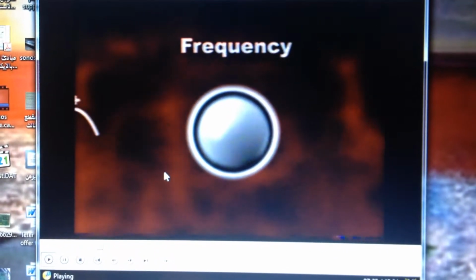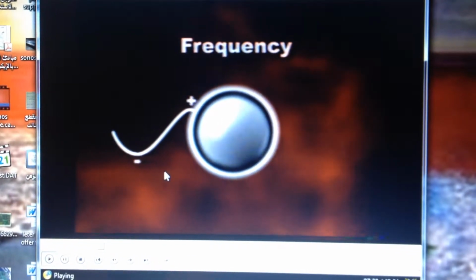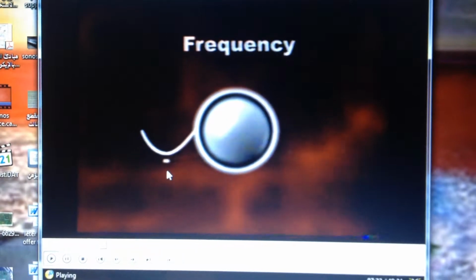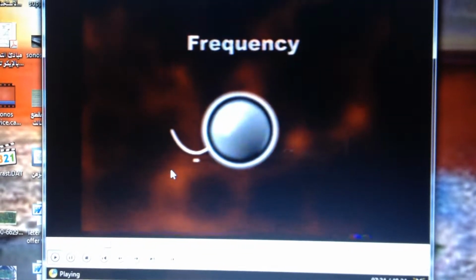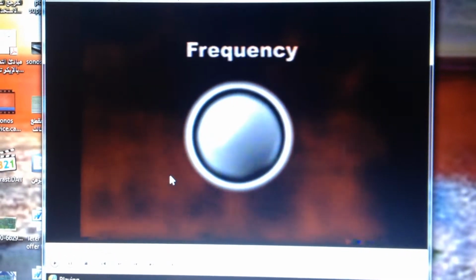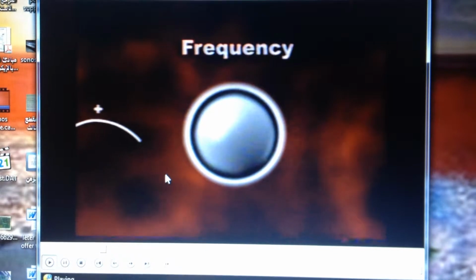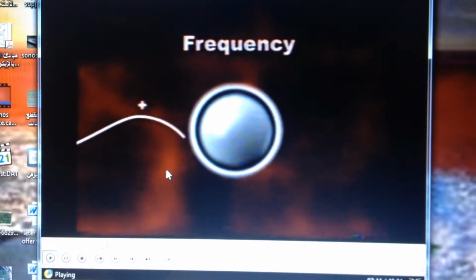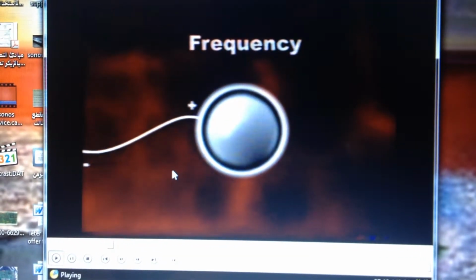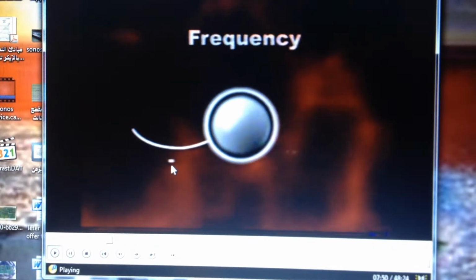Using a generic frequency as an example, you can see that the high part of the sound wave applies positive pressure to the bubbles, which compresses them. The low part of the sound wave applies negative pressure to the bubbles, causing them to expand. The lower the frequency, the larger the reaction. In general, bubbles have a much greater capacity for expanding than they do for contracting.